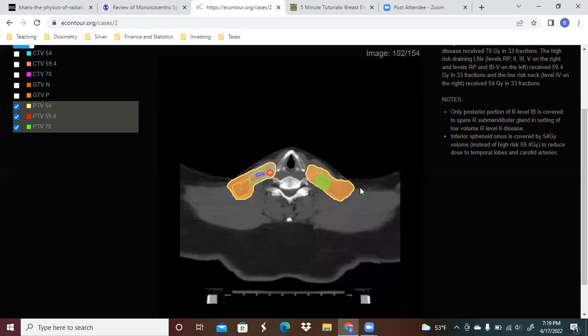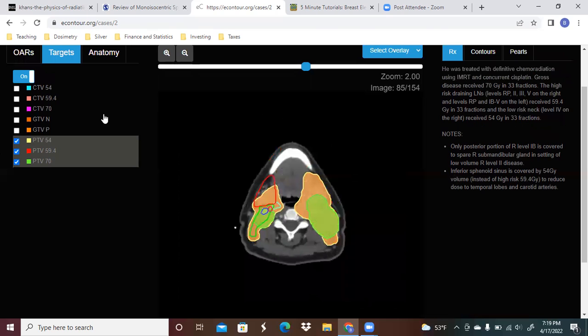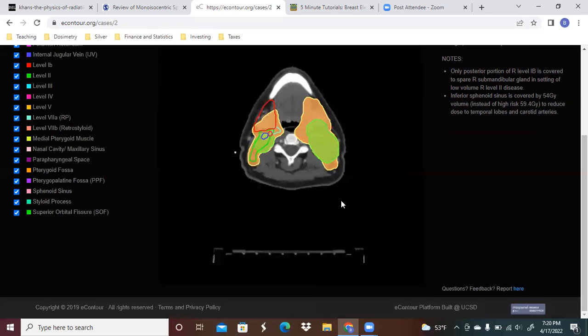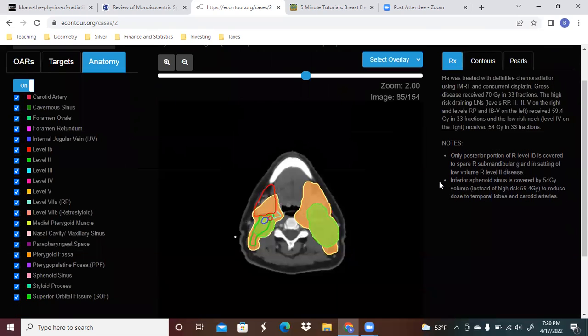So this is just one specific case, and it's got certain elements of the anatomy that you can look at to see what all is involved. This really gets fun when it comes to retreatments. If somebody's already received head and neck treatments and you want to go back and do it again, which nobody really does, but if you have to, at the very least, it can give you an idea as to what some of the tolerances are for these certain structures within the head and neck. What is it you want to hit it with, and what do you want to spare these normal structures with?